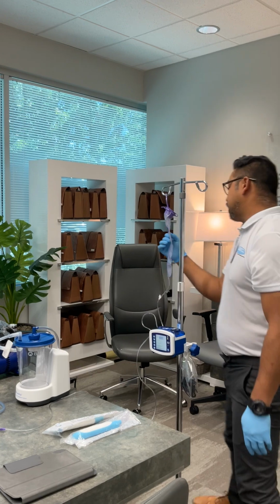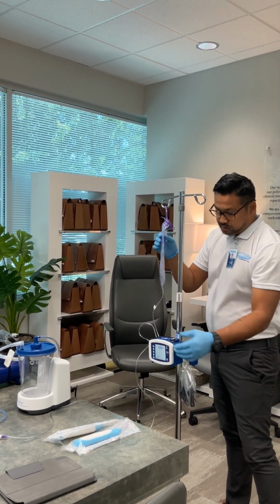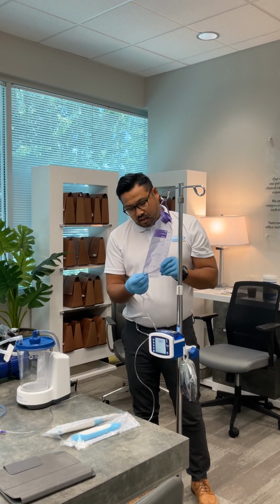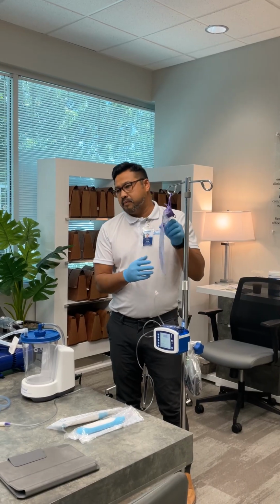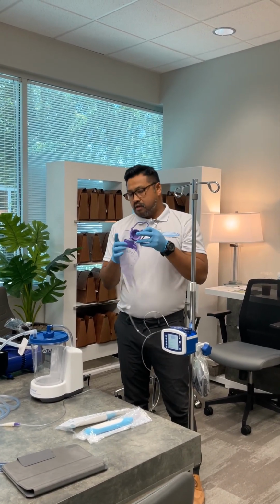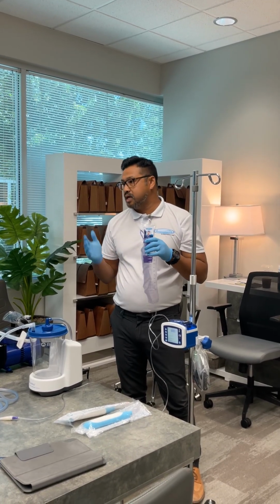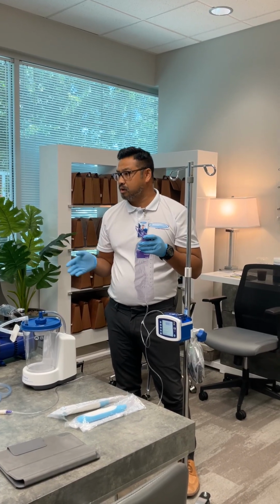These bags are only 1,000 anyways, so you're going to run out of the formula before that and you're going to have to add more. These are, I believe, about a 12-hour bag, as bacteria will start to grow over time. So we give a bunch of these. Usually it's a box of 30, and when you guys are down to your last dozen or so, you just give us a call. We'll mail out some more.